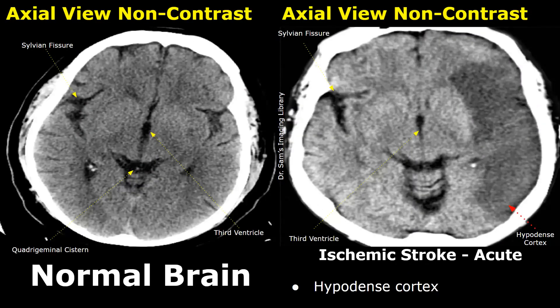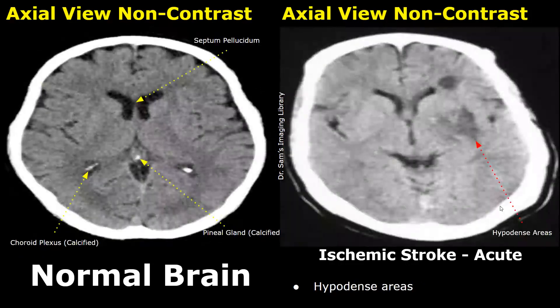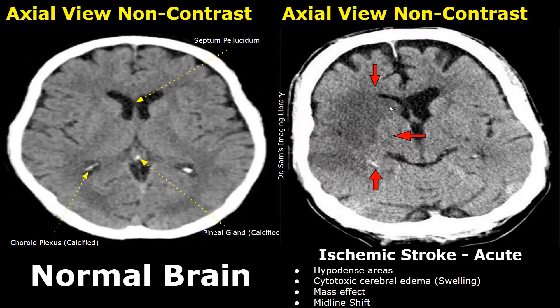In acute ischemic stroke, the time from onset is 24 hours to one week, and its features include a hypodense cortex. Here is another case of acute ischemic stroke — we can clearly see hypodense areas within the brain. As time passes, more features are seen. Along with hypodense areas, we will find cytotoxic cerebral edema, that is swelling, which will cause mass effect and may cause a midline shift.